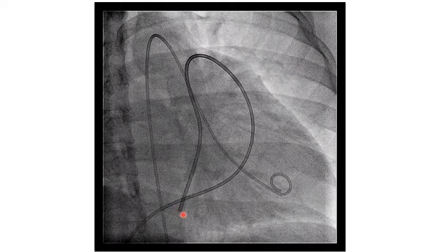Sir, here we take the catheter where the zeroing will come. Wherever the tip is, we will be measuring the pressure distal to that chamber, sir. When you are reaching the pulmonary arterial wedge pressure, you will get the pulmonary venous pressure, and indirectly you will get the left atrial pressure.